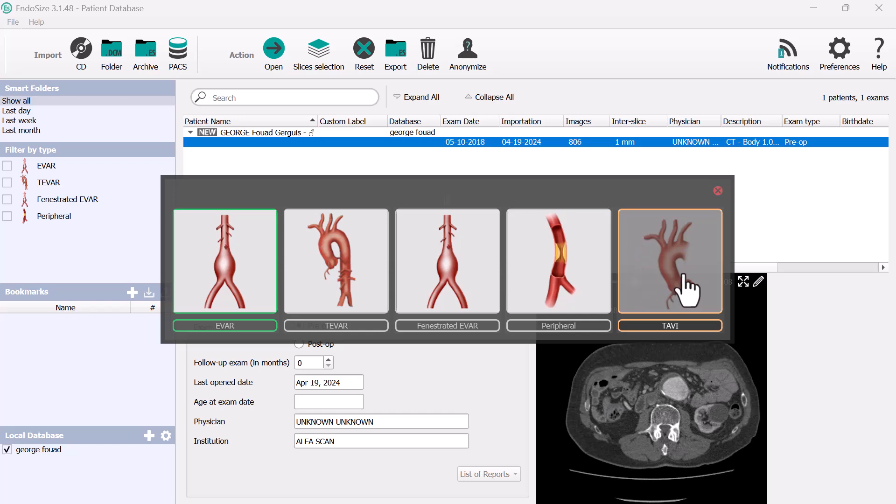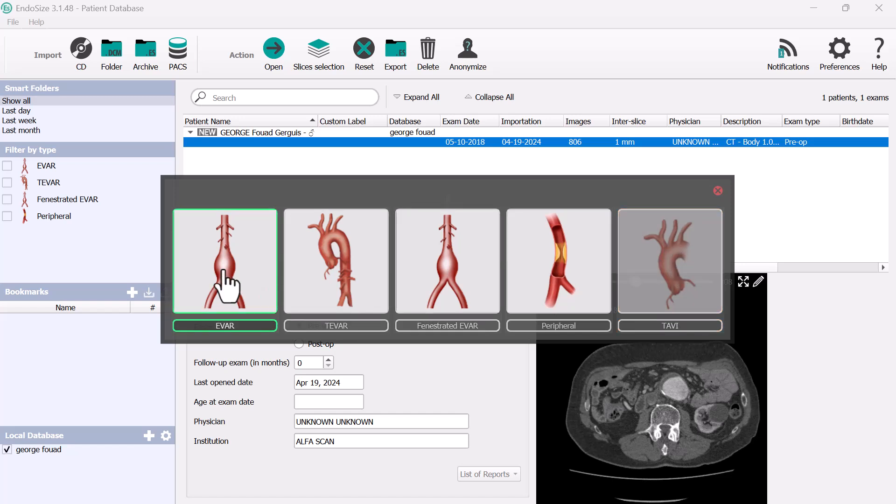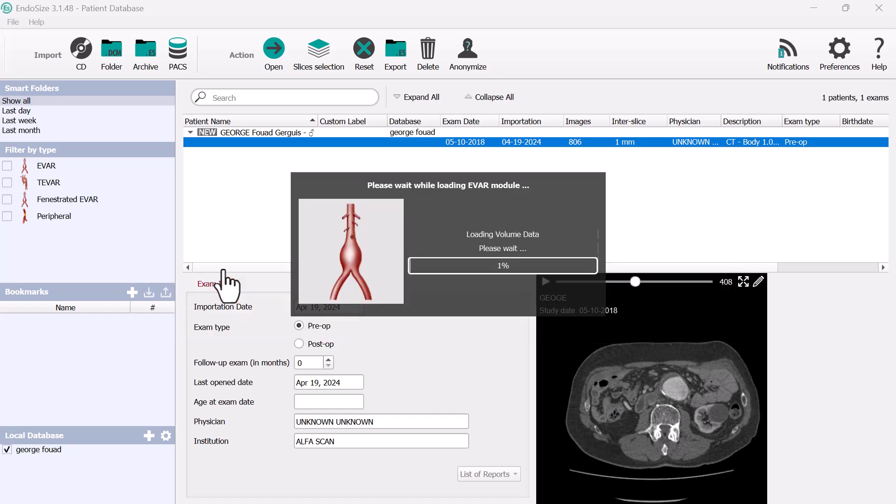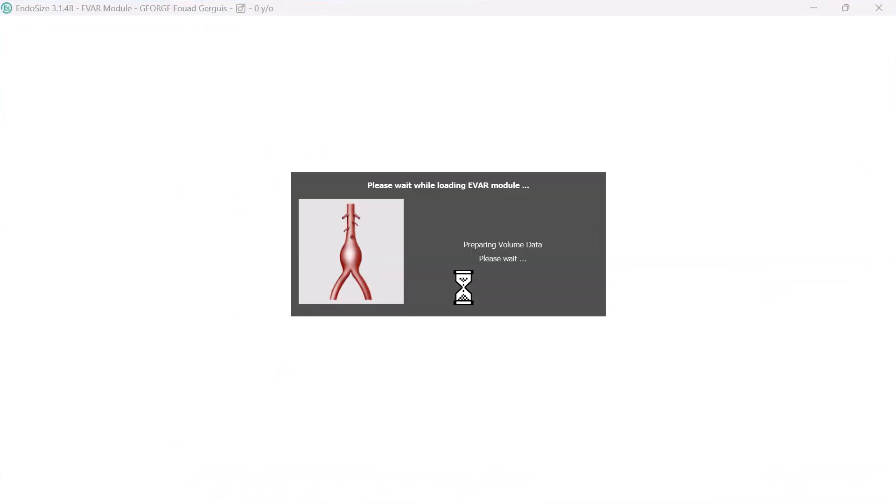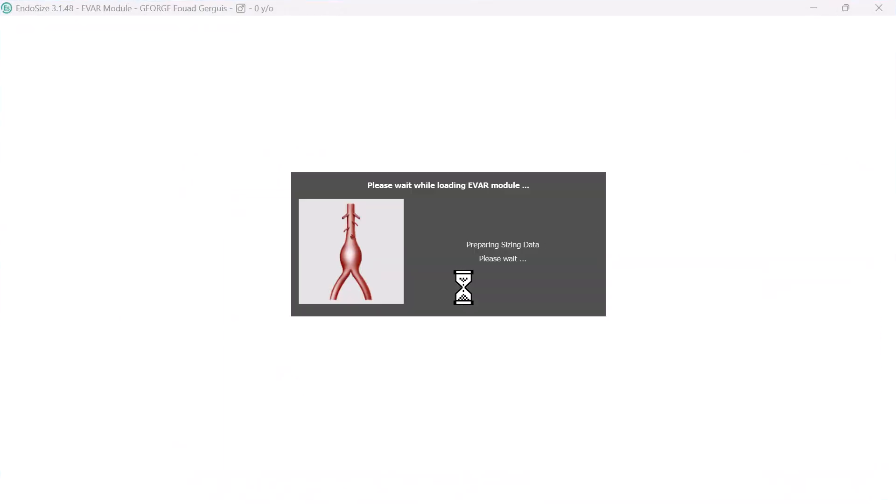And sometimes also if you are helping cardiologists, TAVI is also available for the device. So here you press on EVAR, it will import all the slices of the DICOM loop into the software after you install it to your PC.